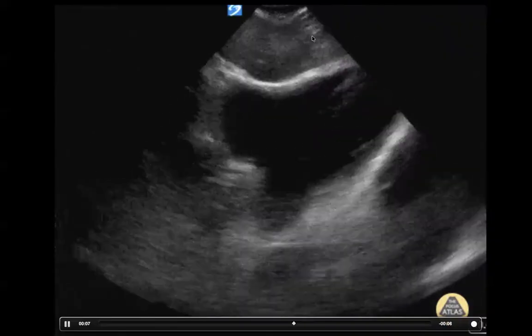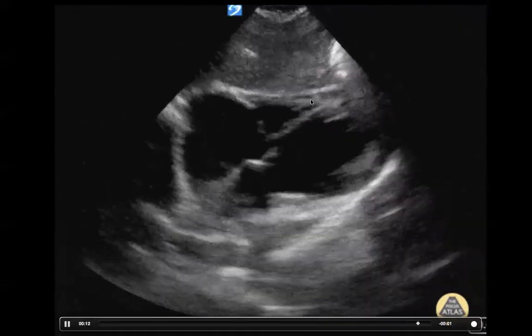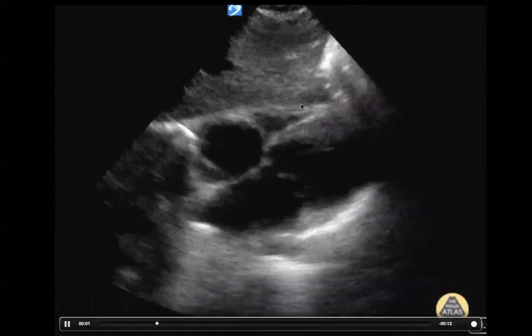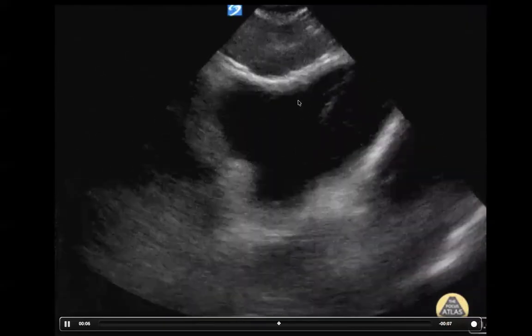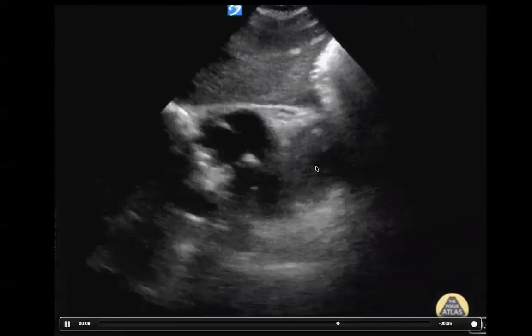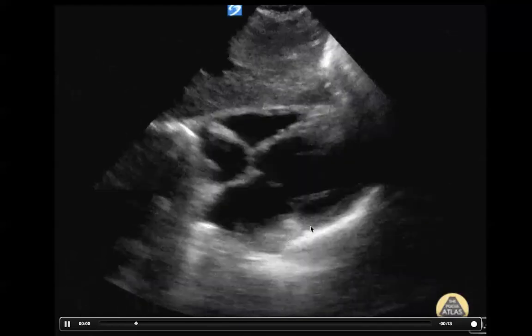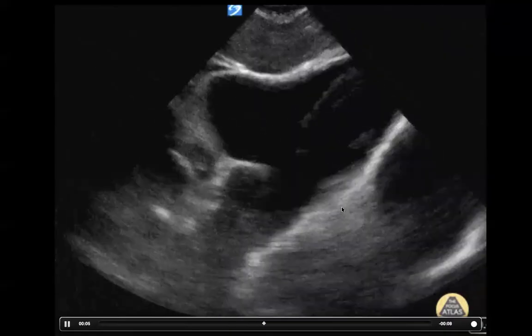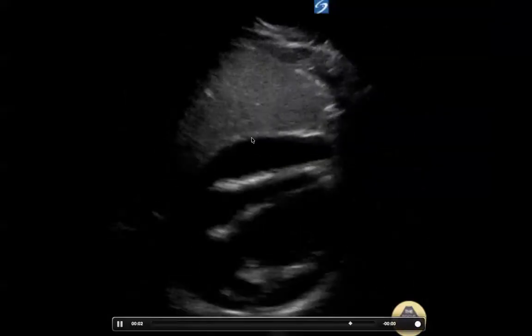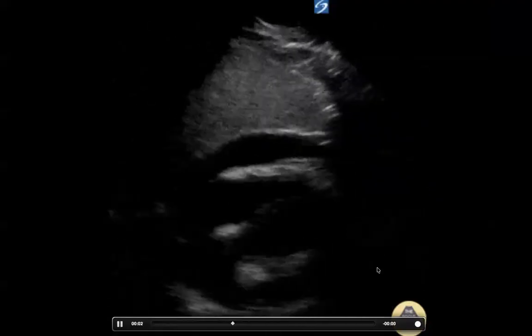This is the liver, right? And so right next to the liver is your right ventricle, because that's the most anterior chamber of your heart. And you can work backwards from there. So right ventricle, right atrium, left ventricle. And so here we have that bright white pericardium that's seen surrounding the heart. And there is no pericardial effusion here, as opposed to this example. Very clear, dark pericardial effusion surrounding the heart. So this is circumferential.